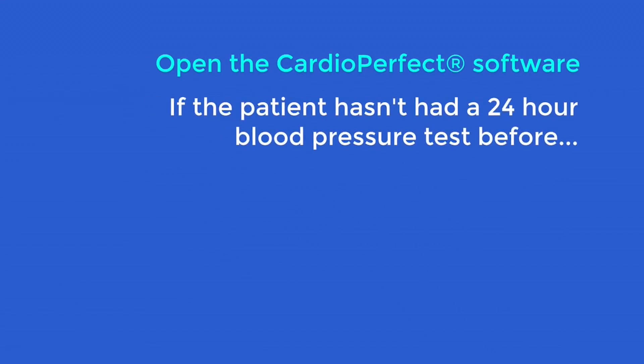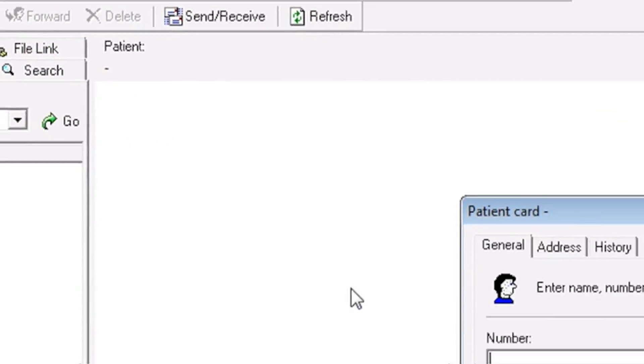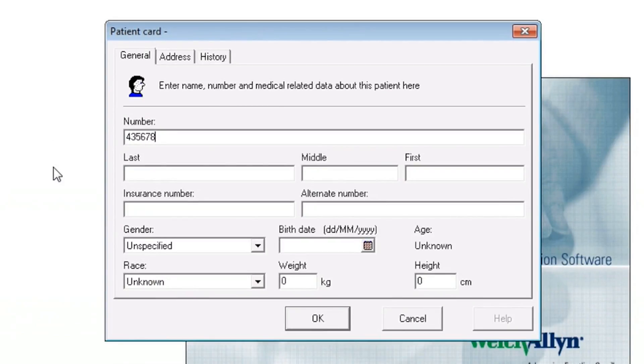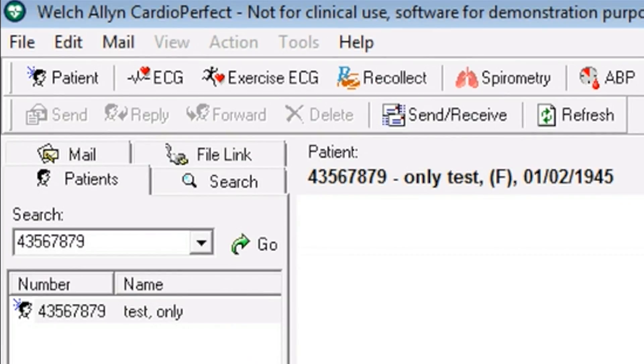If the patient hasn't had a 24-hour blood pressure test before, click the patient button in the top left-hand corner. Enter the patient ID number, the patient's name, their gender, and their date of birth. Click OK and the patient's details are now saved.